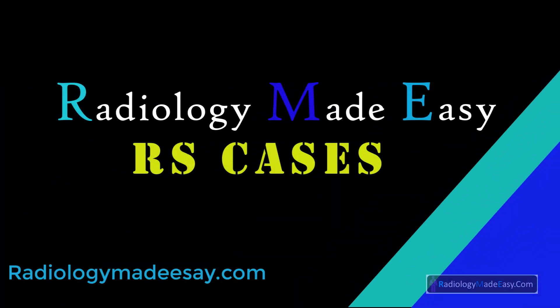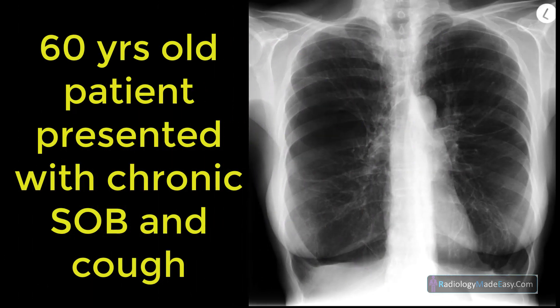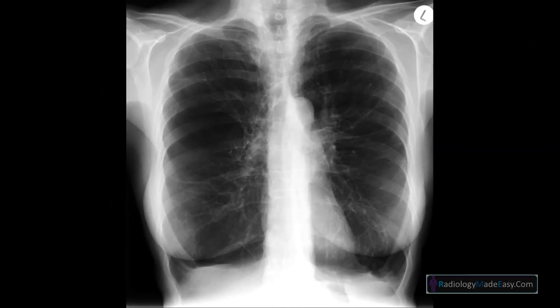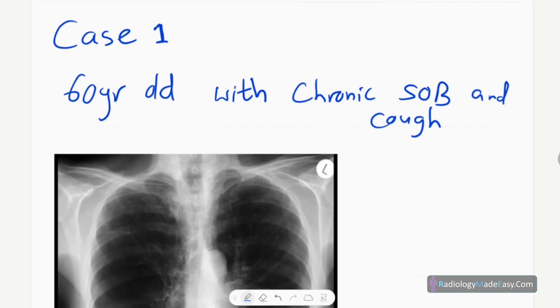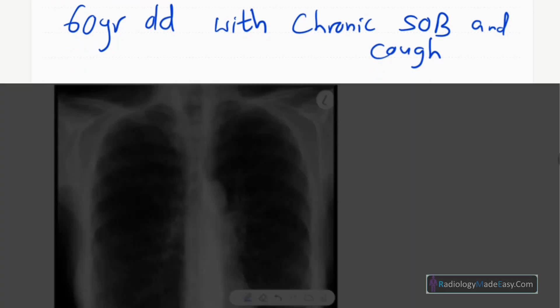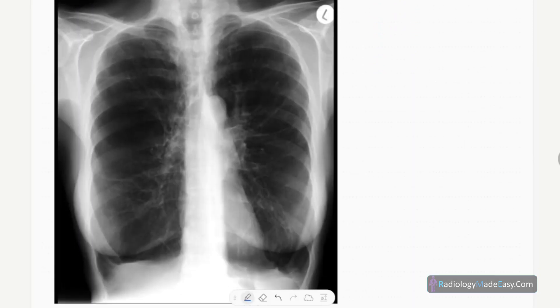Hello everyone, welcome back to Radiology Made Easy, your all-time favorite YouTube channel. After finishing the MSK series in radiology, we are now going to start the RS (Respiratory System) series. This is case number one — a 60-year-old patient with chronic shortness of breath and cough. This is the frontal chest radiograph of a skeletally mature female patient.